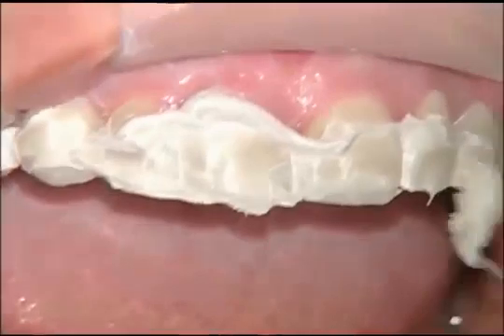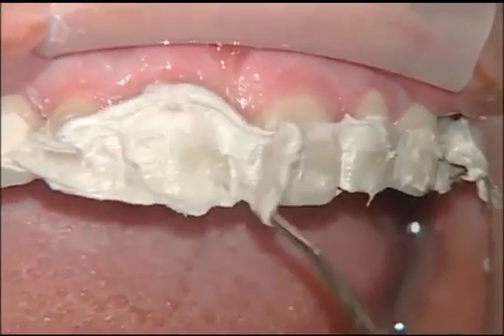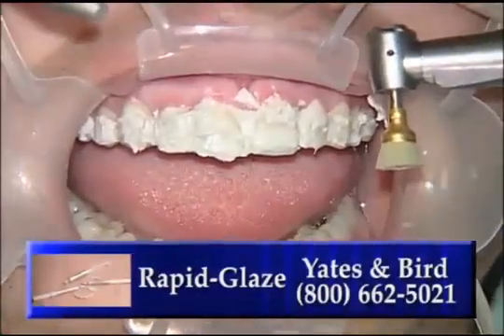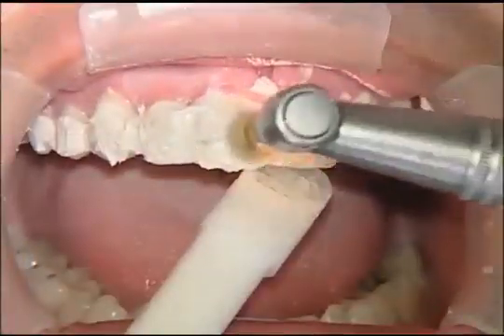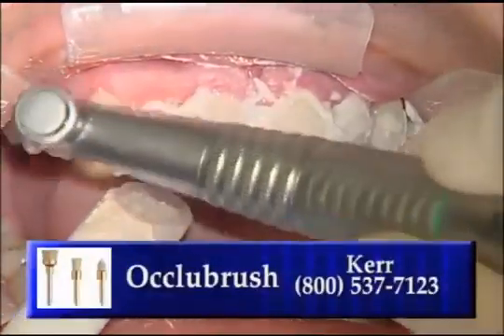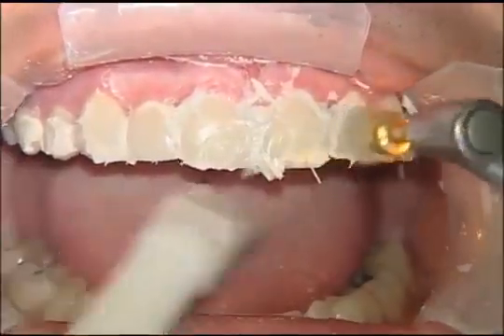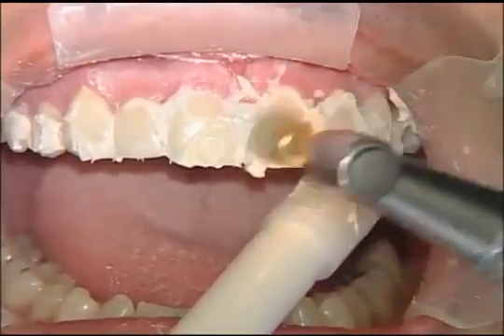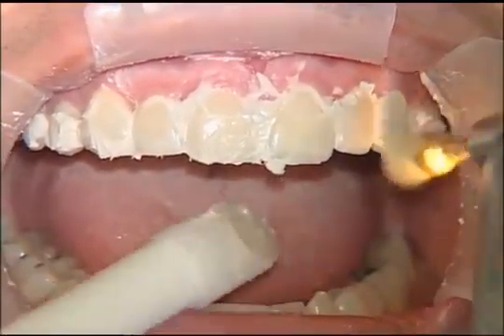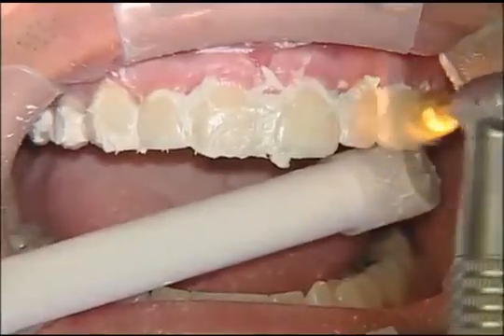After we finished polishing with the Brasseler Dialite series of wheels, we're going to go in with a product called Rapid Glaze, and we're going to place this on the facial surfaces of the teeth, and we're using an Oclu brush here. This is from Kerr Hawe. This is an aluminum oxide impregnated brush that goes in a slow speed. And we're going to use this at relatively low speed, 5,000 to 7,000 RPMs. In the beginning, we're going to use heavy pressure and then lighter pressure to really put a nice high shine on the facial aspect of our ceramic veneers.